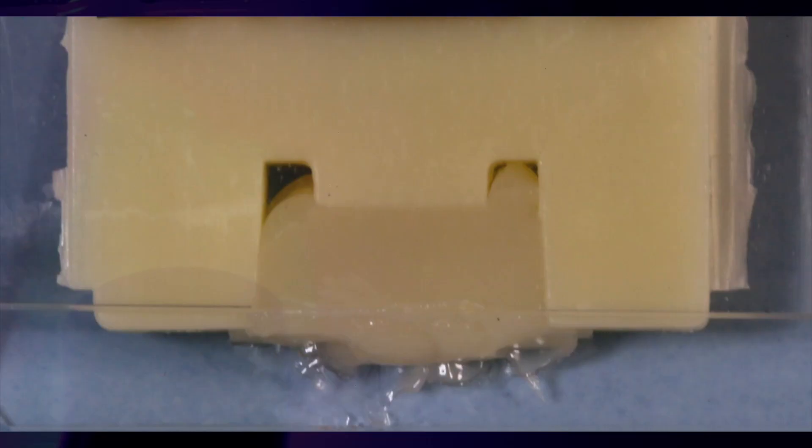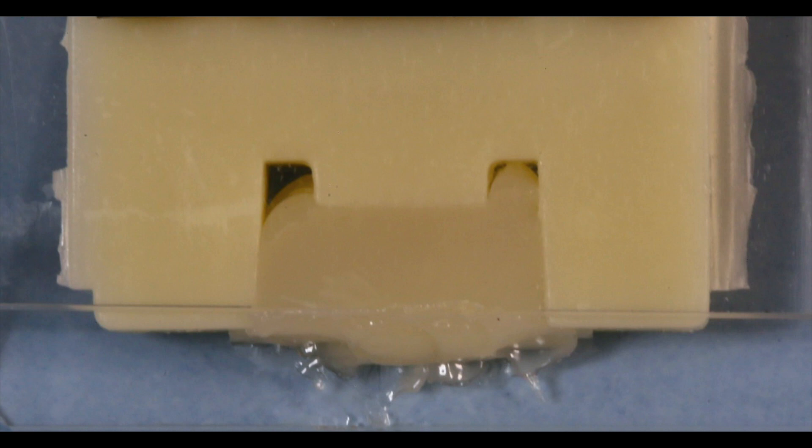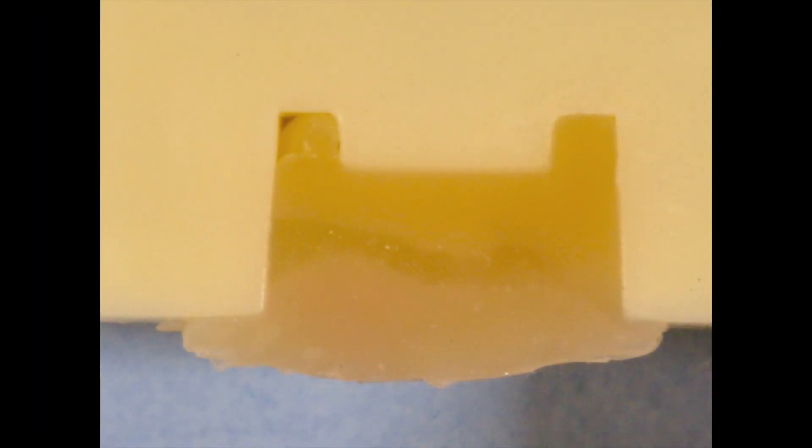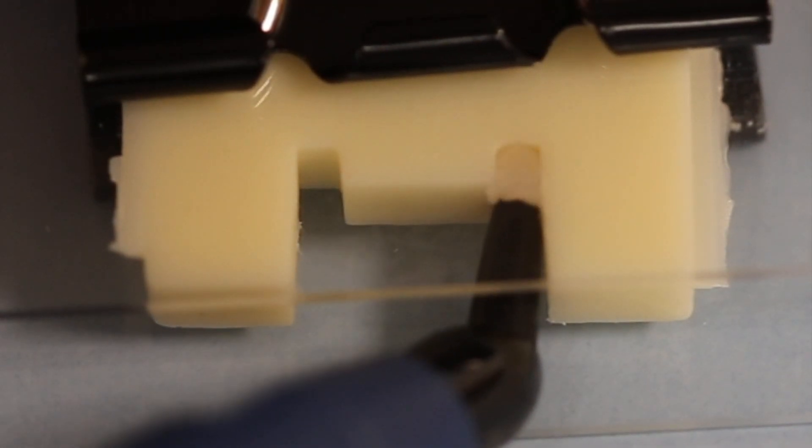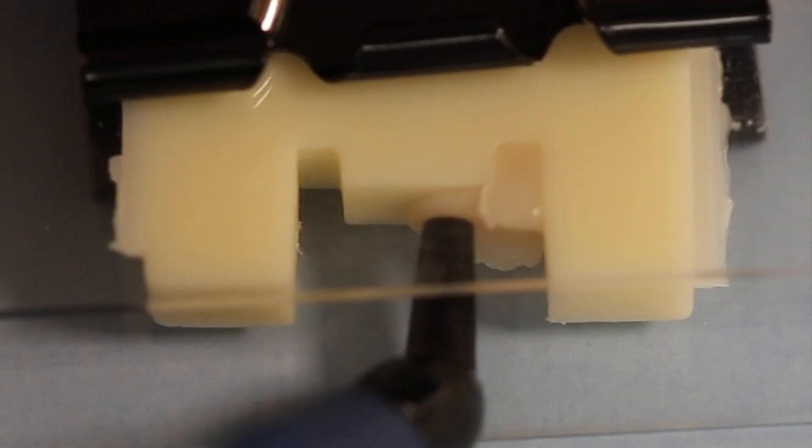I hope you found this video illuminating, because rarely do we see what happens when we fill a cavity with composite. My preference is to use the heated compules and inject directly into the cavity.